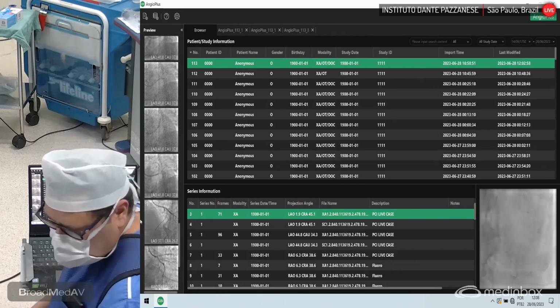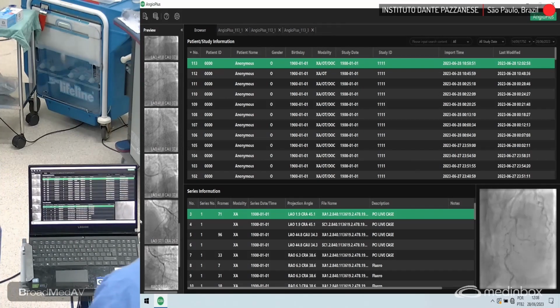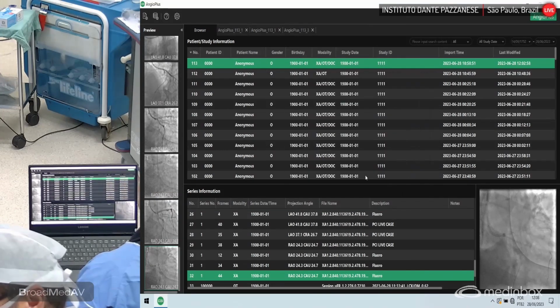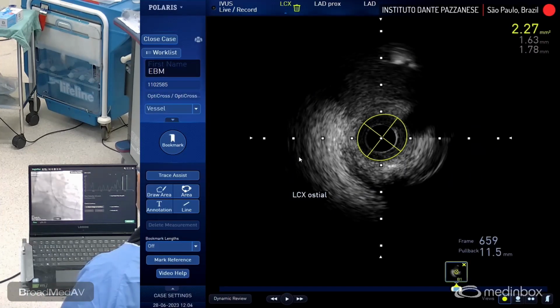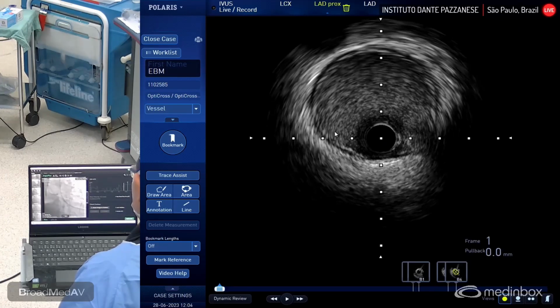Can I have the IVUS on screen, please? IVUS now. Can I have IVUS, please? Instead of physiology, I want to have IVUS. Okay, IVUS, please.